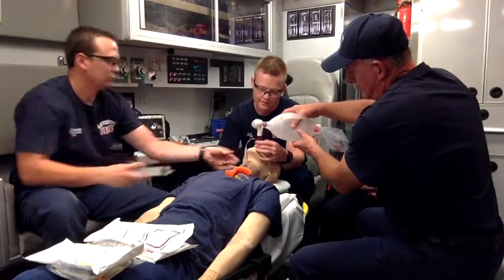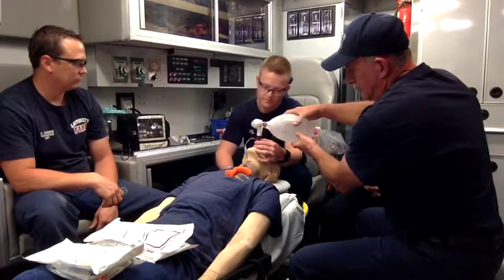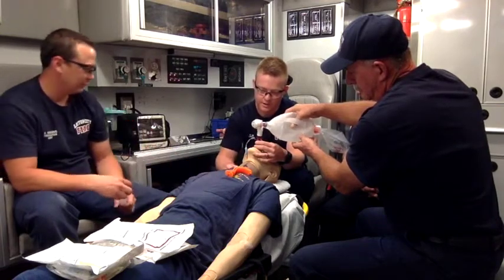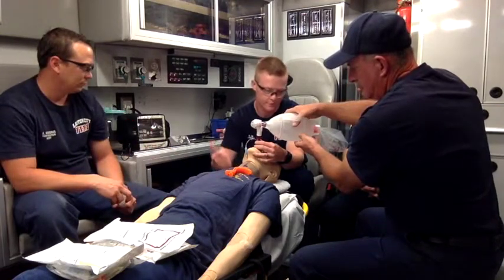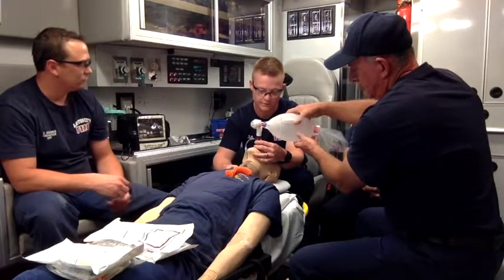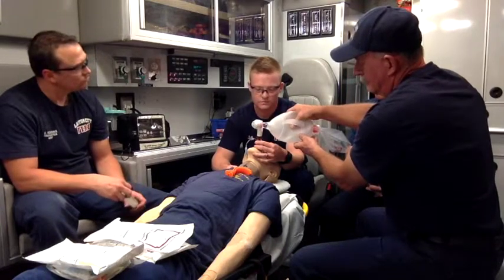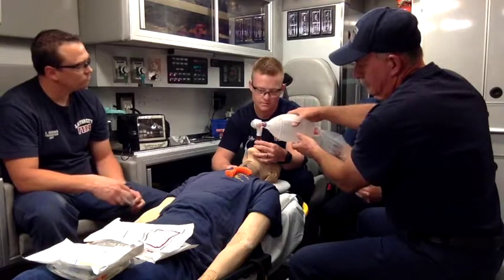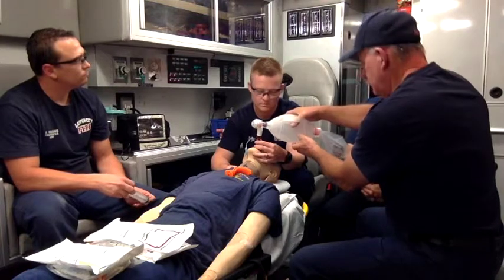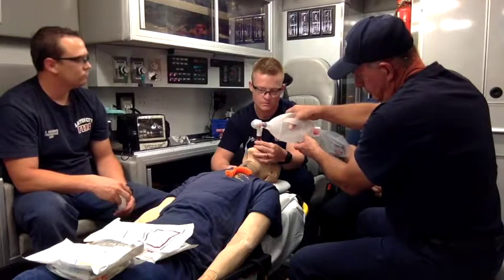And then as he fills that up, it kind of backs up a little bit just to seat there behind that tongue, that back cuff. Okay. So we're looking for a good chest rise and fall. We can do capnography. We can do pulse oximetry. What's the best one? Capnography. Yeah, capnography. So just like for intubation, it's our gold standard. If we've got good perfusion going on, we should pull off good capnography. And that, in fact, is probably the biggest thing that I've seen with the AutoPulse and good attention to CPR: we're pulling capnography off people right away.